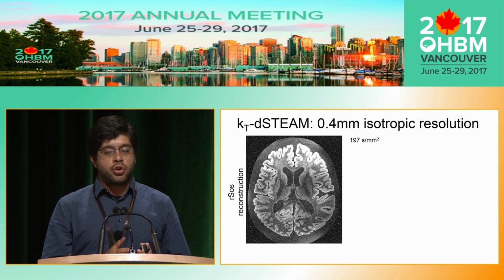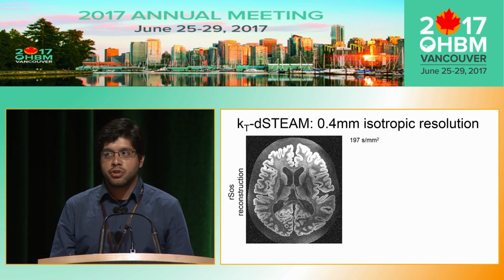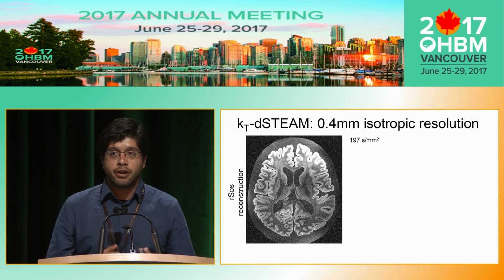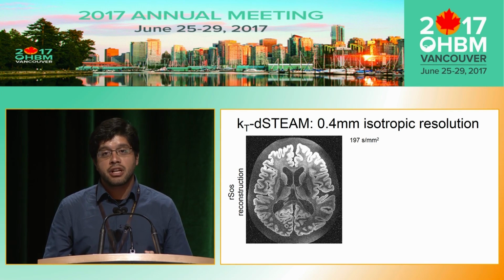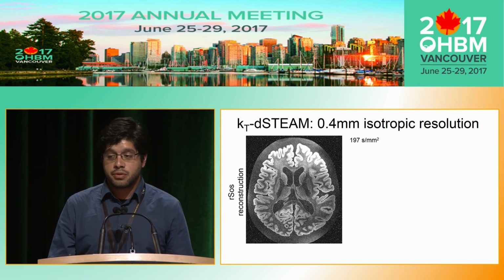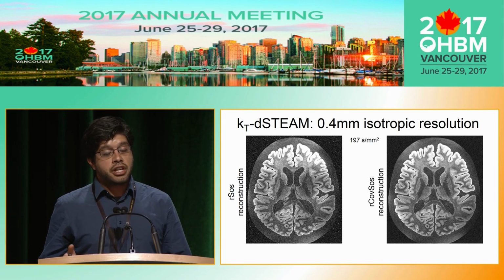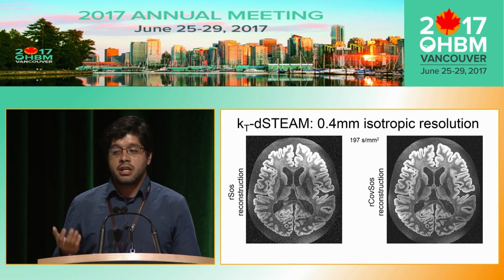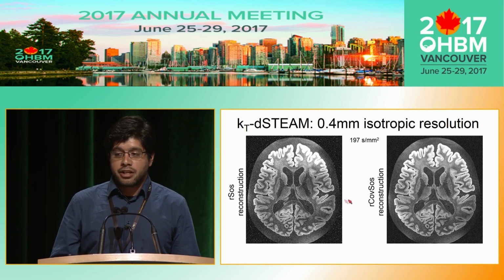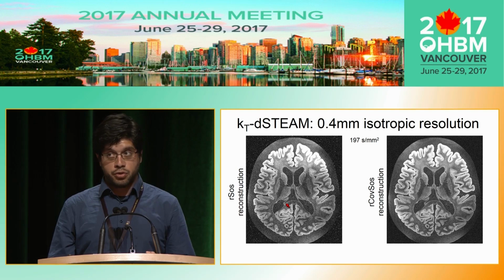We already have a coil that can perform a very efficient acquisition. We have a scanner that can give us quite high resolution images. We have a sequence that can work with any kind of sample. So we can move forward and try to explore the reconstructions. As you can see here, we move from a standard reconstruction, that is the sum of squares reconstruction that the scanner usually offers you.